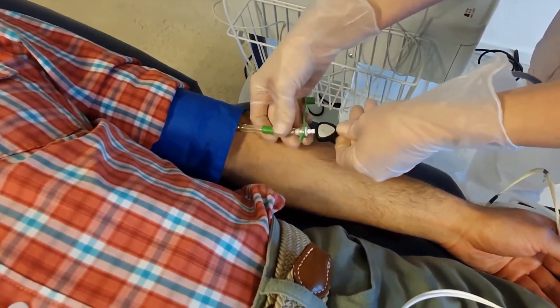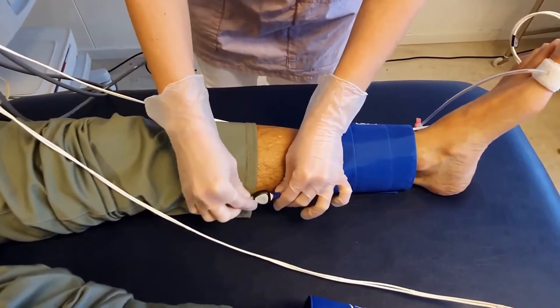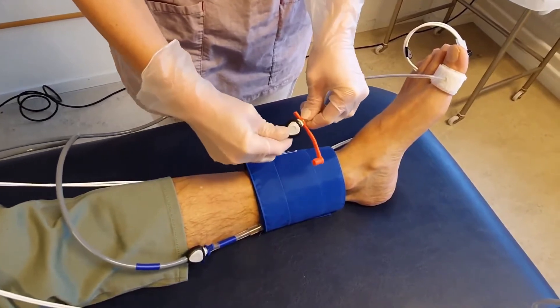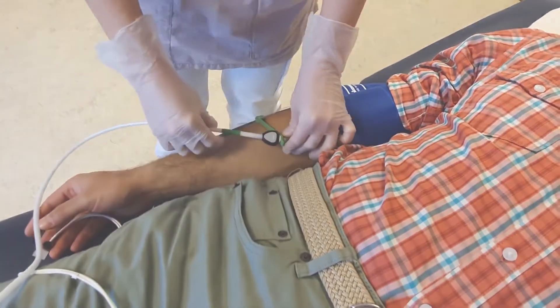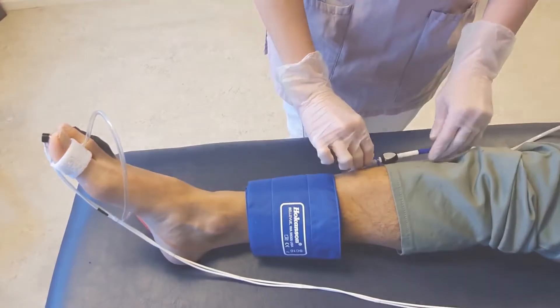The system also features a built-in air compressor with six outlets. The pressure tubes are connected to the pressure cuffs and the pressure can be individually set in different cuffs. Tubes and sensors are clearly marked for easy application — this is important particularly in the presence of mediasclerosis, where brachial pressures can be set to a lower level than the ankles.